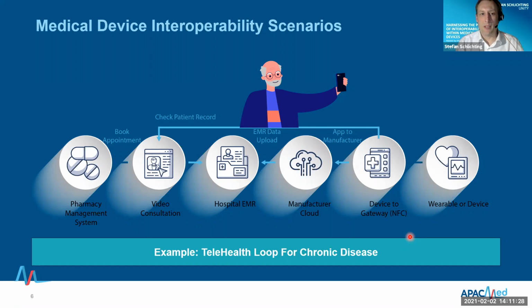So it's a really good scenario that has all aspects in it, from managing the clinical workflow, getting data from the devices, and combining it with what is already known about the patient in the hospital, so that those who take care of the patient have the full picture and can really help him. And I think we will discuss a little bit about the scenarios later during our panel discussion.